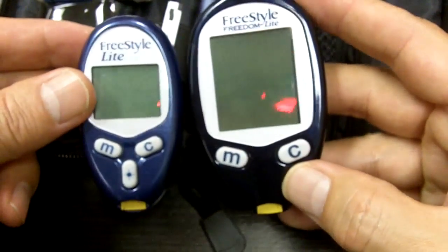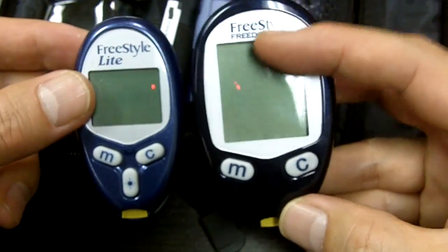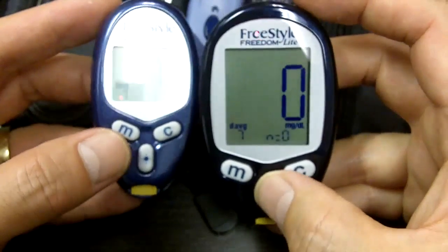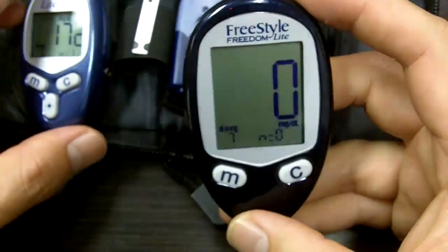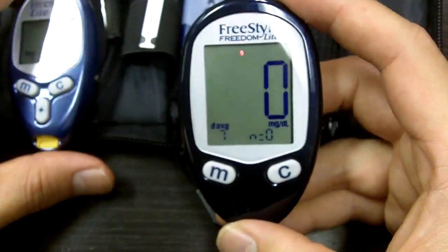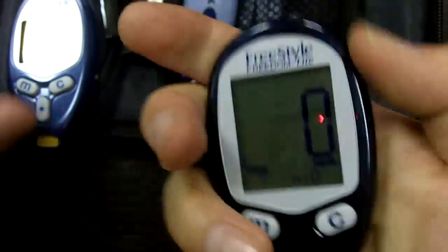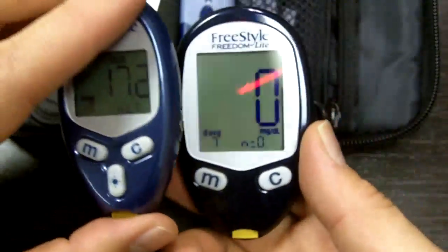There it is — you can see there's a huge difference. This one is nice because it's small; the Freedom is a little bigger, and the screen is bigger. The numbers are just much bigger. It takes the same amount of blood and the same test strips. This meter, compared to the Lite, is really for people that maybe have a hard time seeing things. It's also bigger, so you can hold it a lot easier — the ergonomics are nicer, versus the Lite which is kind of small. I think that's the biggest difference, at least in my opinion.